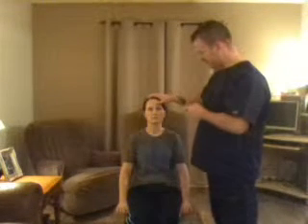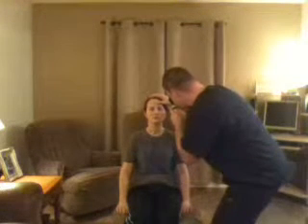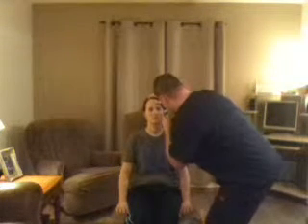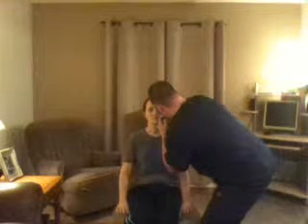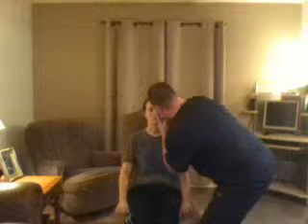I'm turning my ophthalmoscope on. I start back far enough where I can see the reflection, and then I slowly move in on the patient until I hit 1 to 2 inches. Using the diopter to change the focus for clarity within the retina, I should be able to see the macula, the optic disc, the vessels, and the retina. That evaluation will be completed on both sides.